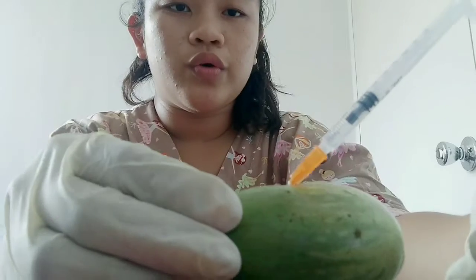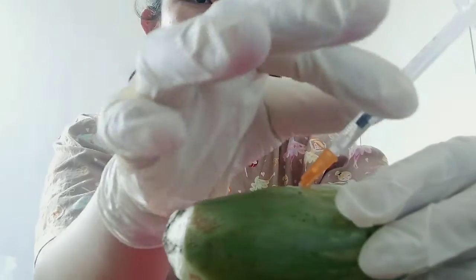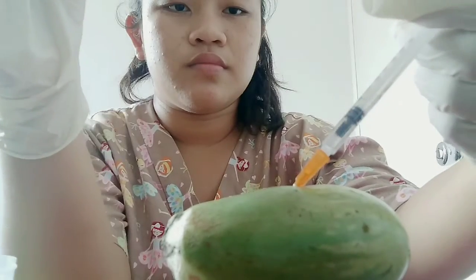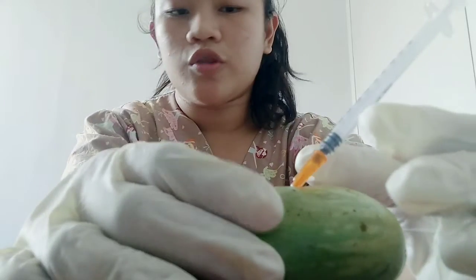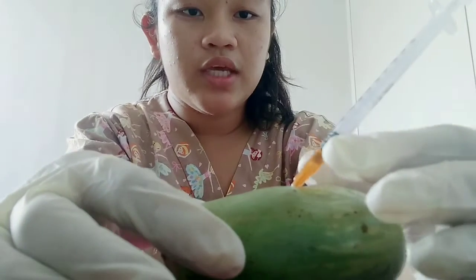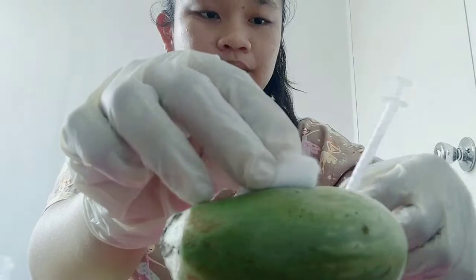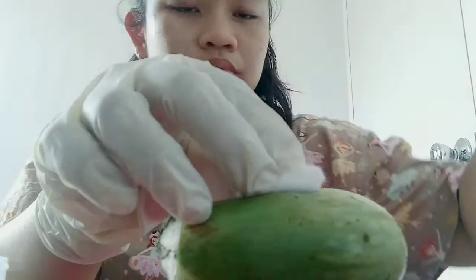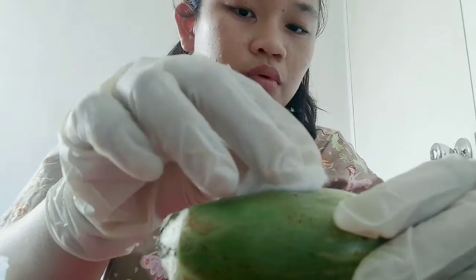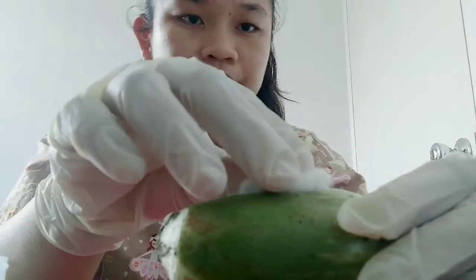Then we are going to inject the medication over several seconds. Then we are going to quickly withdraw the needle and place the swab on the site, and don't massage the area.